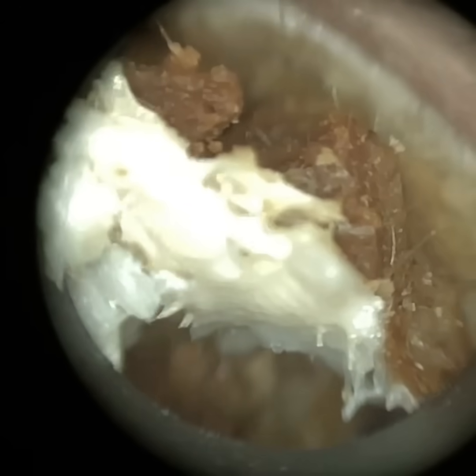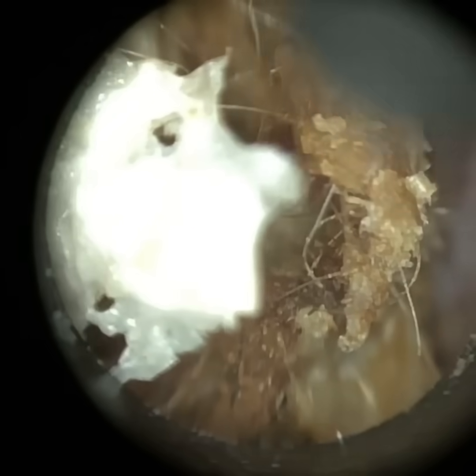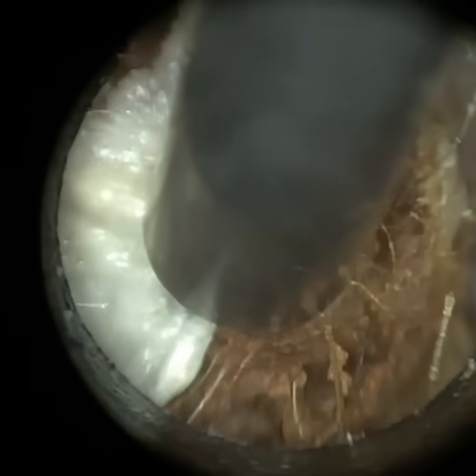If we left this ear alone, that outer layer would eventually be compressed into the core, oxidize and become dark, and be replaced by another layer of freshly secreted dead skin, which appears more white. This is probably in the last third now — this last plug. Just trying to get a suction grip; getting that skin helps to remove the plug, which it did.